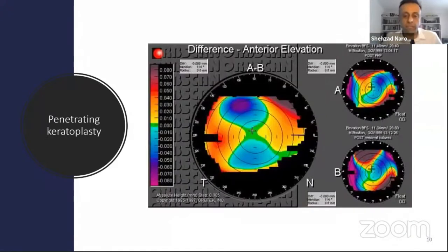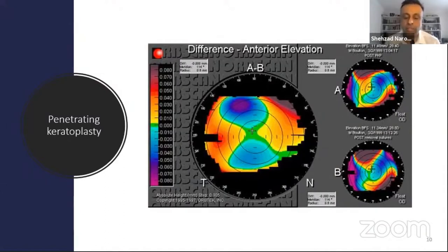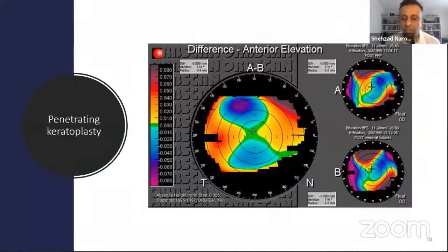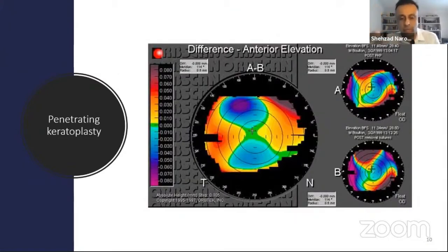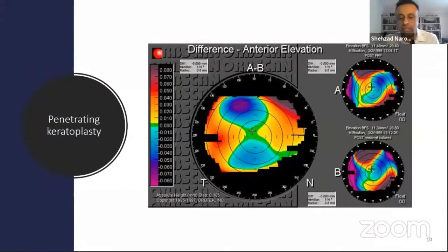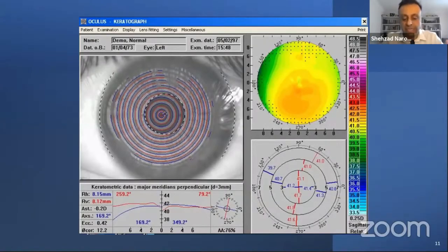This real patient had a full-thickness penetrating keratoplasty (corneal graft). Post-graft, they had considerable irregular and regular astigmatism, with best-corrected visual acuity no better than 6/12 to 6/9. We took a pre-treatment topography map, then selectively removed sutures — in this case around the 11 o'clock position — to relax that meridian. The post-treatment topography became more regular, allowing us to perform a successful spherocylindrical refraction.